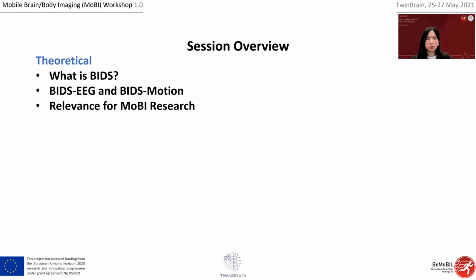It's true that we also record many other modalities along with EEG, not just motion. You can also use eye tracking or EMG, many other recordings. But because I am developing BIDS motion, the extension for motion data, together with Julius Welzel, it's a great opportunity to stir up some discussion and get some feedback. And then its relevance for MoBI research might already be obvious at this point, because all the previous speakers were showing you all the fancy setups with many, many pieces of hardware and software. So data management is not a trivial matter for MoBI data.